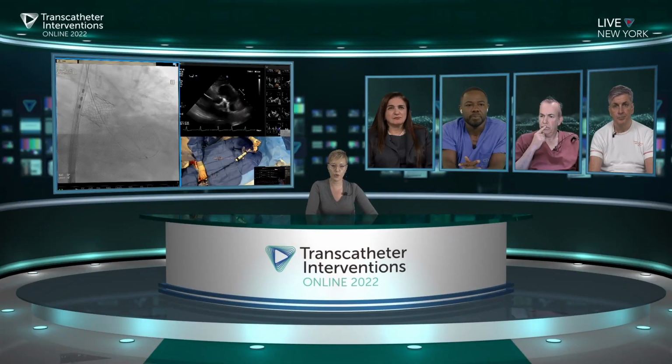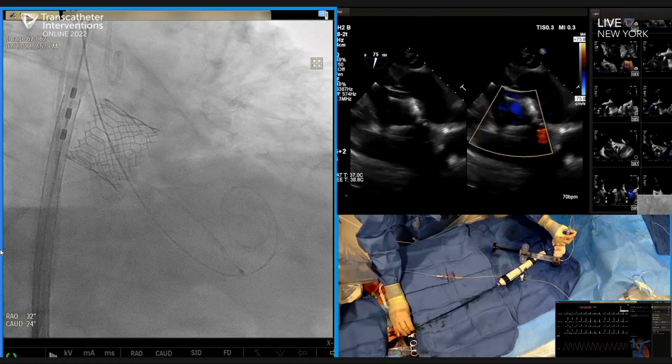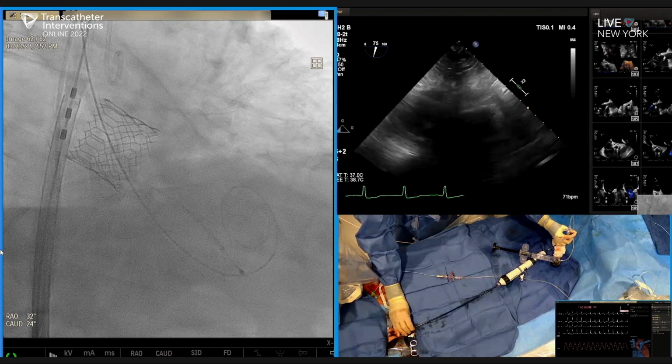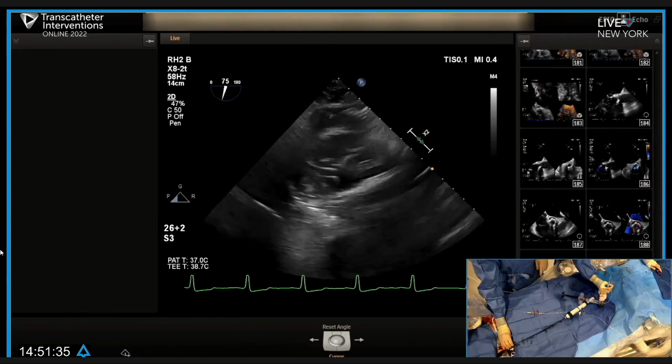So Becky, can you show us the paravalvular leak again and determine if you think this needs to be post-dilated? Yeah, we prefer to do it from a gastric view, so that's why I immediately went into a gastric view. But some of this is central, so I don't want to overcall the regurgitation. And the hemodynamics, the diastolic pressure is 90.